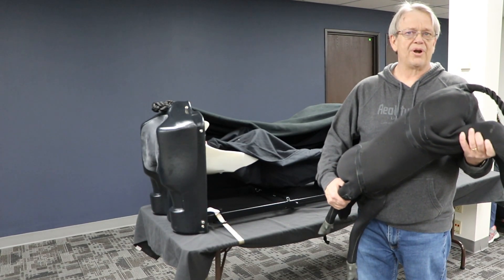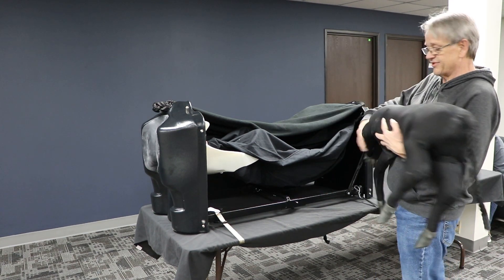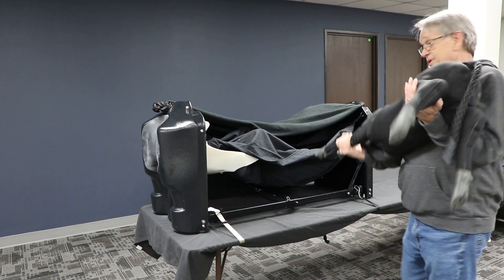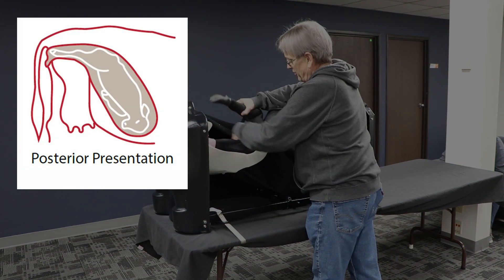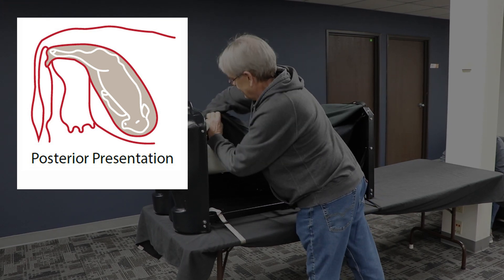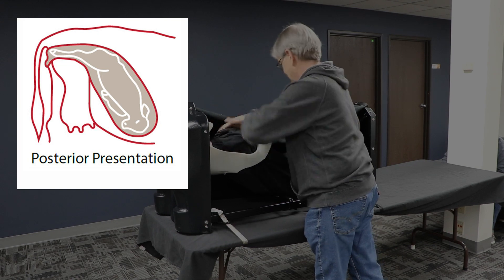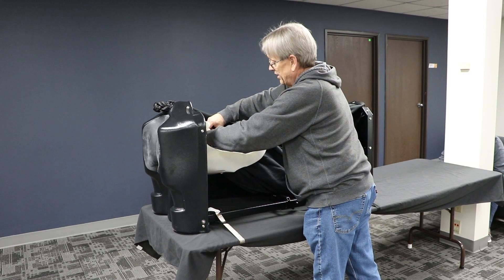Now a rear presentation. I'm going to lay the calf in on its belly with the rear legs out the birthing canal toward the back, tail up. I zip up the uterus bag.